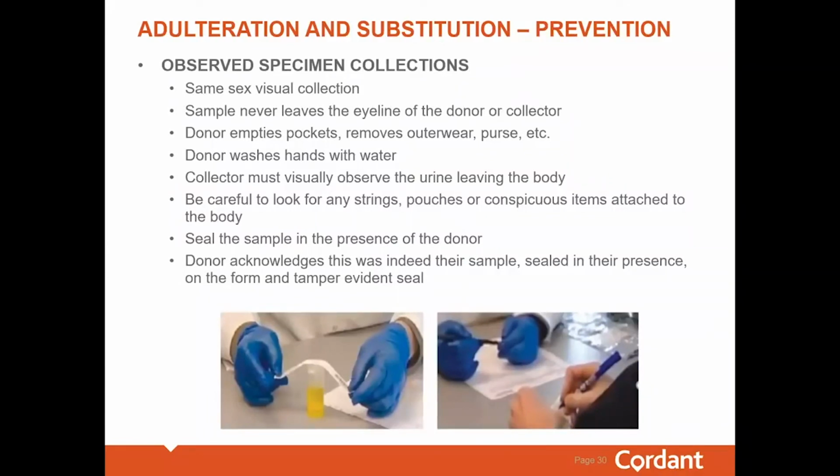Inform the donor that the collector must visually observe the urine leaving the body. Be careful to look for any strings, pouches, or conspicuous items attached to the body. Always seal the sample in the presence of the donor and have the donor acknowledge this was indeed their sample and sealed in their presence on the form and the tamper evidence seal.